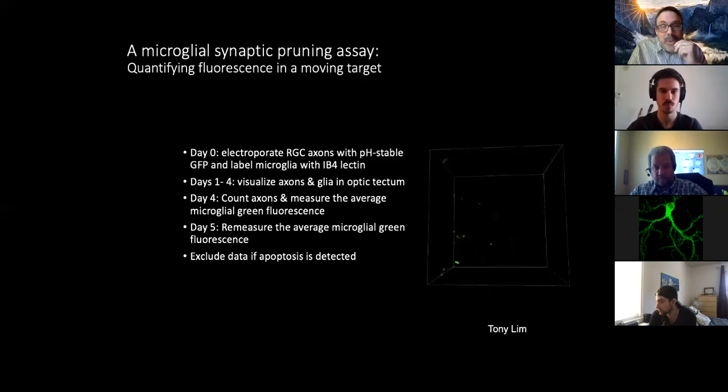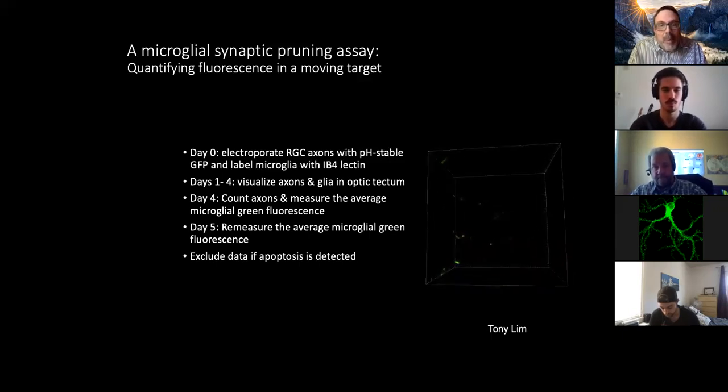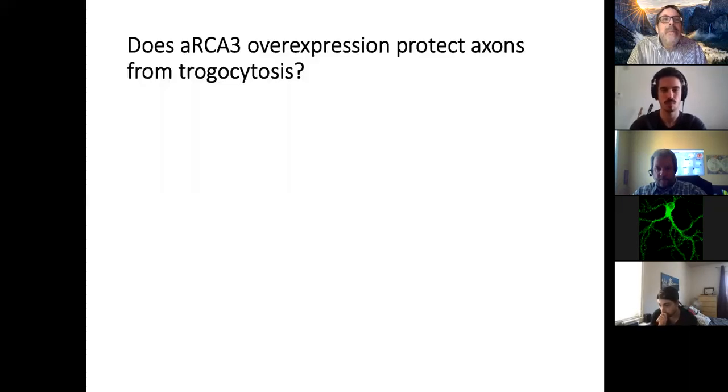The other nice thing about this approach is that he can count the number of green axons in the tectum. These are retinal ganglion cell axons. And if an axon dies, then all bets are off, right? You don't want microglia to pick up the green fluorescent protein from a dead apoptotic neuron. And that's, you know, half of the neurons will die from apoptosis during this time period. So that's a real confound. But what's nice is that we can follow those axons pretty much from the moment they arrive in the tectum until the end of the experiment and know that none of them died. None of the GFP-positive axons have died. And then we can just do this quantification.